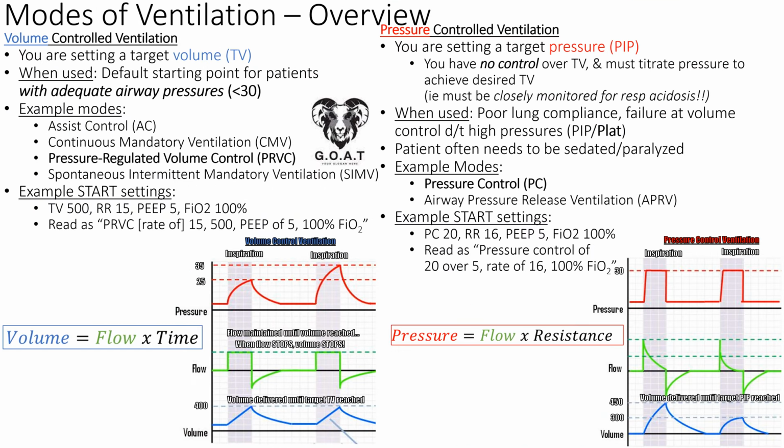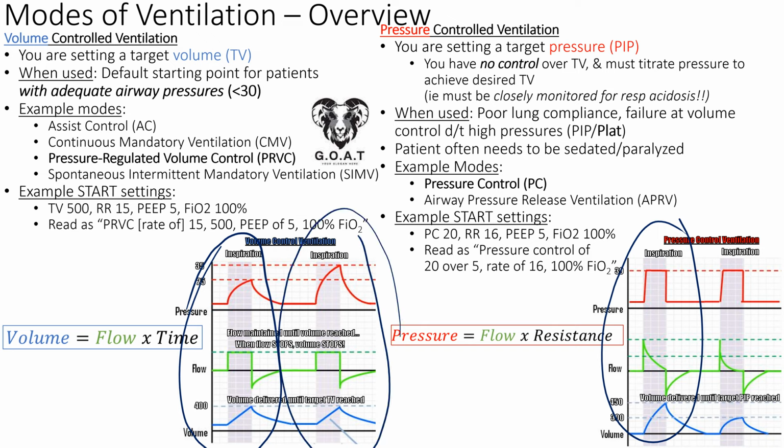So again, volume control ventilation on the left here. There's a healthy patient. And on the right side is the unhealthy patient. All right, patient A, patient B. So in volume control ventilation, you're setting a what? A volume. A tidal volume, right? You say 400, 300, 600, 800. How do you know if 800 is good for them? Usually not more than 550, 600. But how do you know it is the ideal tidal volume for them?